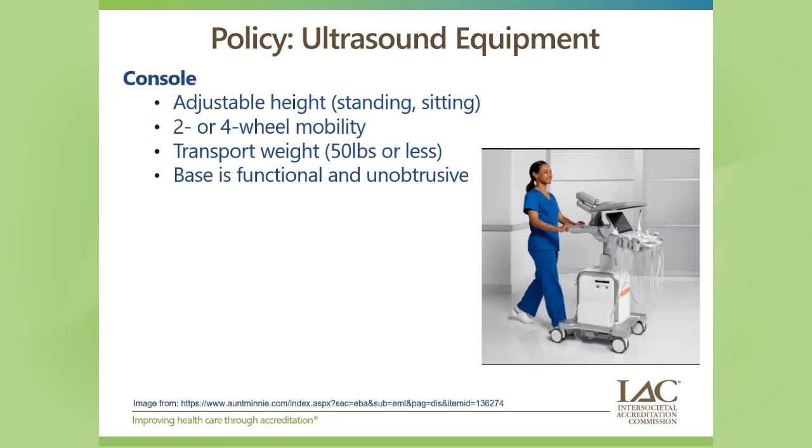Then talking about that console, as I mentioned earlier, the height needs to be adjustable. And as far as the ultrasound systems, they want to have it adjustable for the majority of us users. So that, if you think about the height range of us in our field, it would hit most of us if you think about that normal curve as far as working from a standing or sitting position.